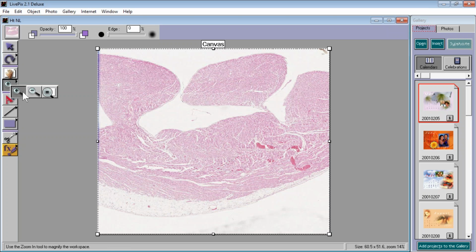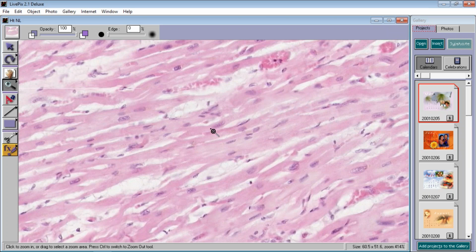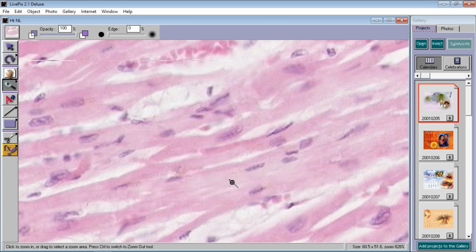And I'm just going to show you Histology 101, the classical features of normal cardiac striated, cross-striated muscle. They have nuclei, often in the middle of the fiber. They interweave with each other. And maybe, just maybe, if you're lucky enough on H&E, you might see some striations going this way.